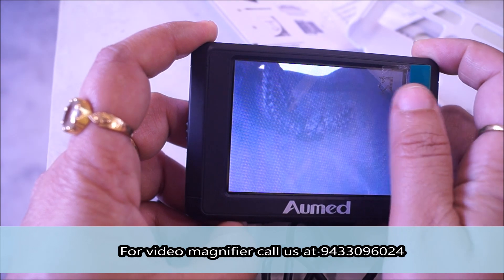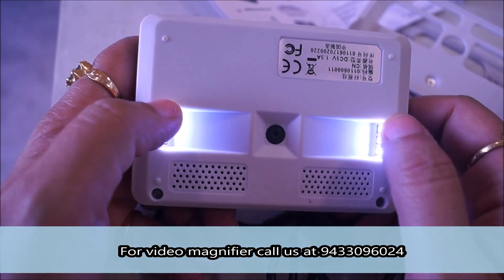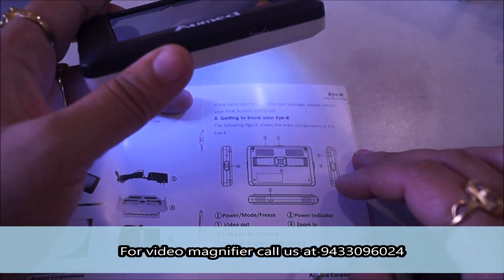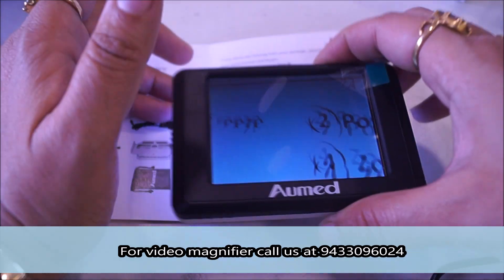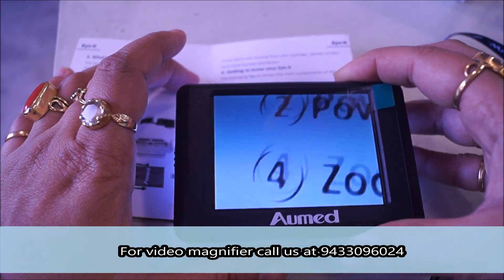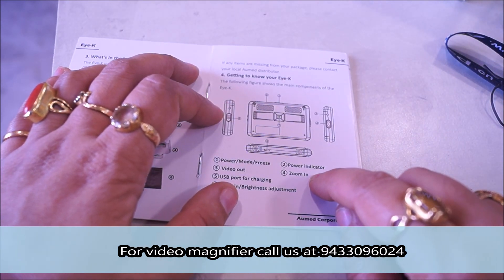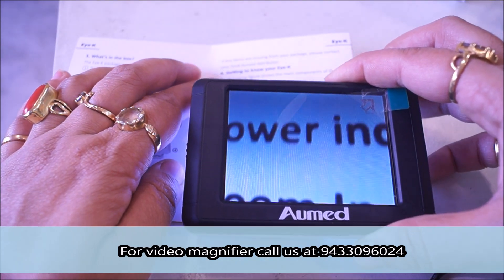The screen size is 3.5 inches. There are 6 LEDs and this is the camera. Now suppose this is the text a person wants to read. You can see the magnification. The word 'Power Indicator' is written here — this size is very small — and here you can see the magnification is increased.